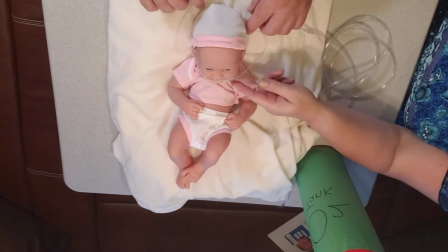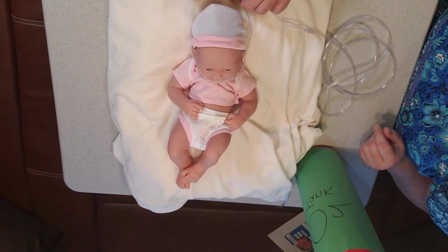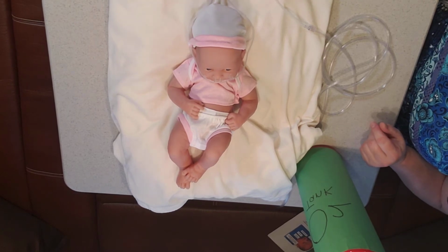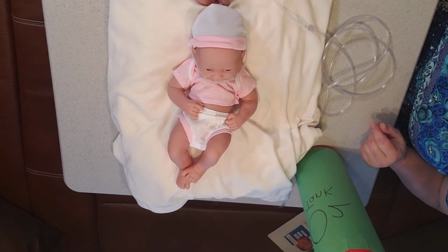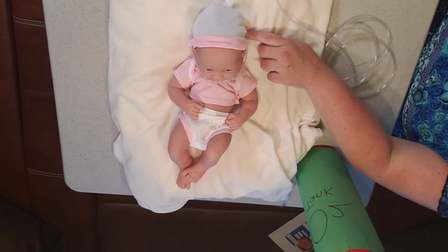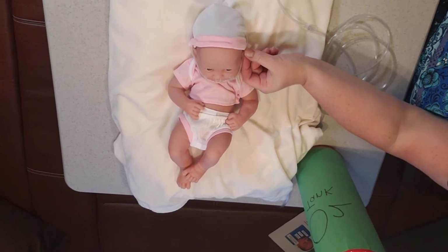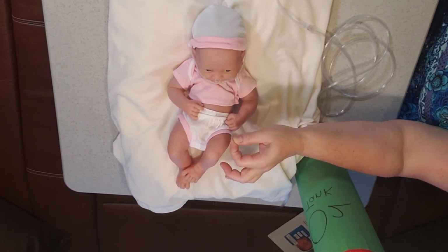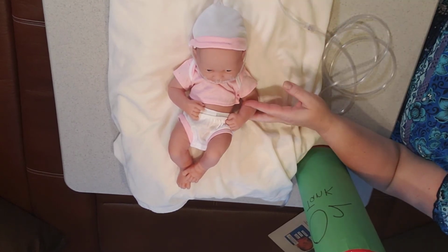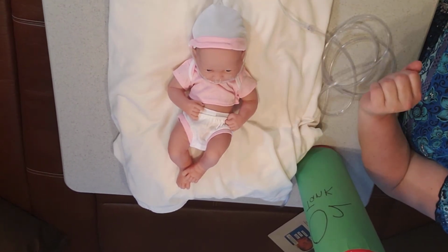And I'm going to make sure that, as you mentioned, this is in a good position so it doesn't bother her. She can't get her hands tangled up. And then I'm just going to take up the slack with this right here. And that's it. For older kids and adults, you can actually put this around their ears and tie it in the front. But for babies, I recommend putting it in the back, because they can end up pulling it out very easily with their hands.